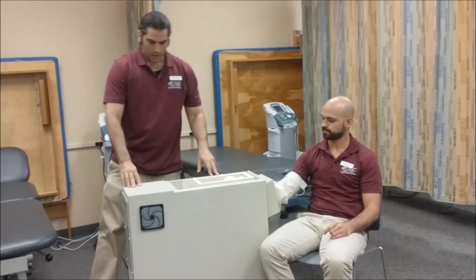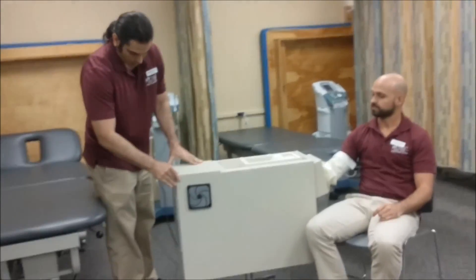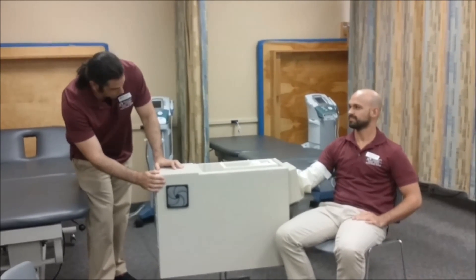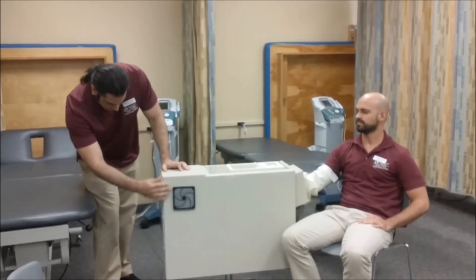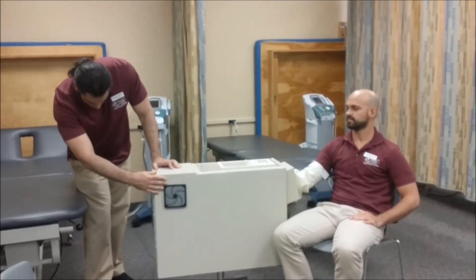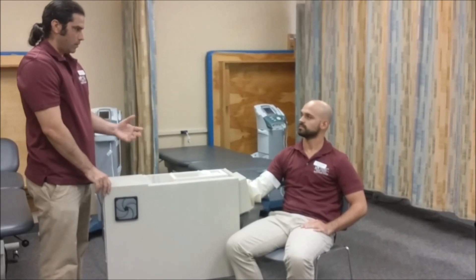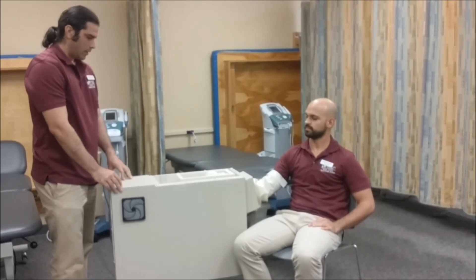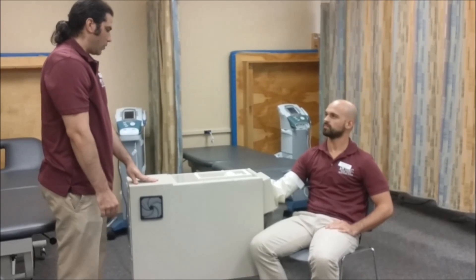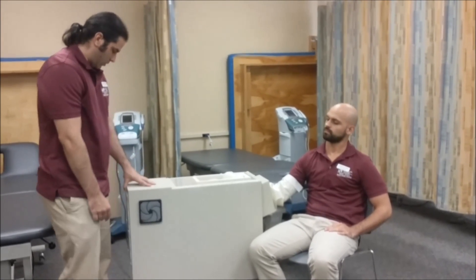So the treatment time is going to be 20 minutes. The temperature is going to be preset to 118 degrees, and the airspeed is going to be set to 100. You can move your hand during the treatment, and in five minutes I'm going to ask you to lift your hand a little to shake it in.